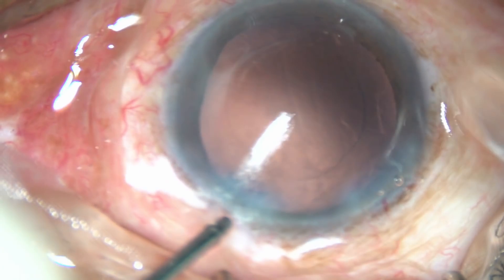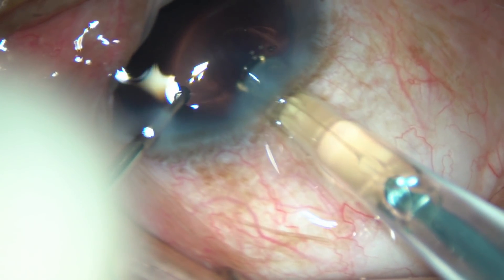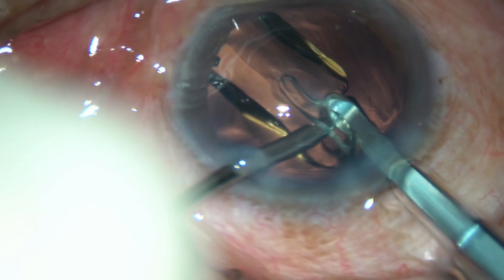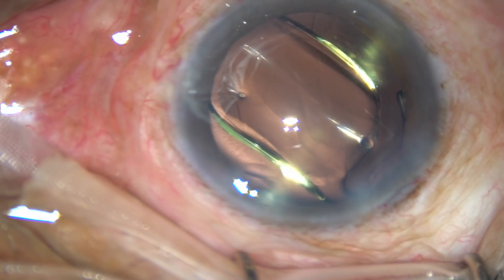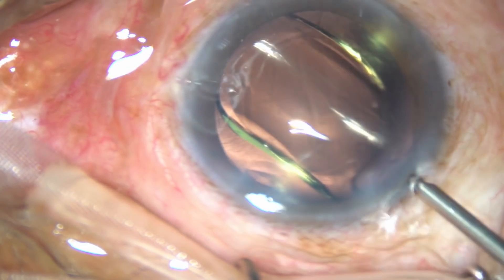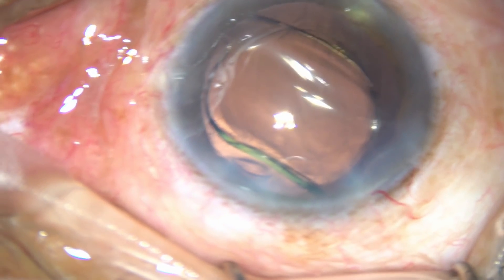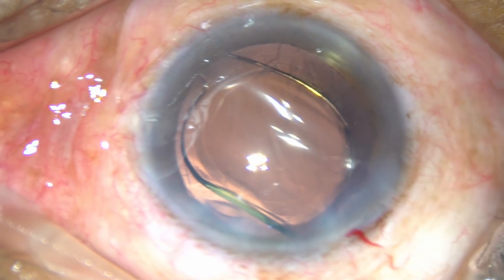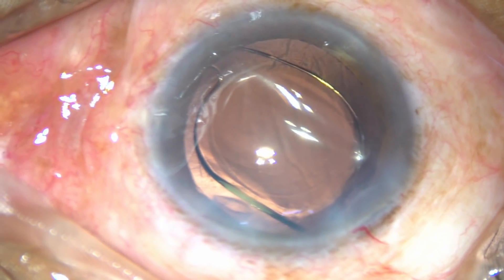By this time, the cortex has been cleaned and a hydrophobic acrylic intraocular lens is being implanted under irrigation. This is the Appa Samis Supra — Super 4 actually. It is a beautiful lens that goes through a 2.8mm incision very easily.